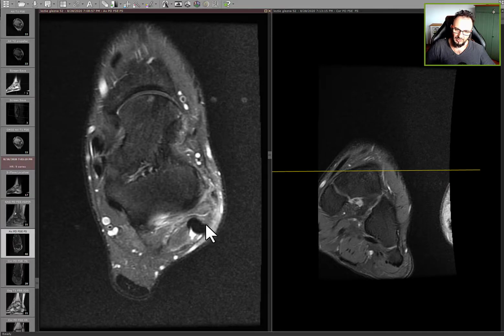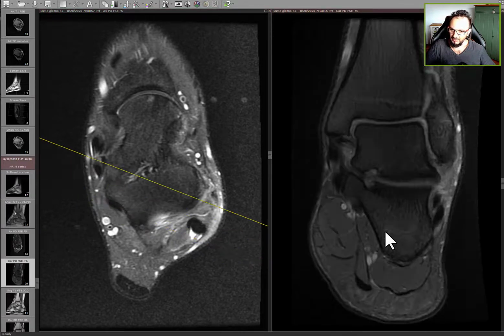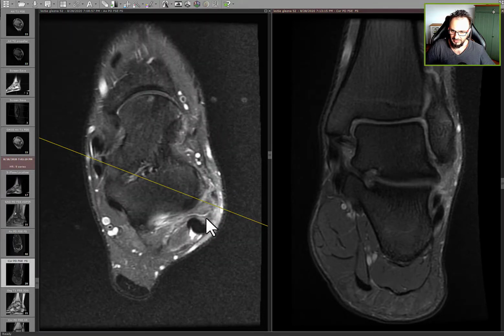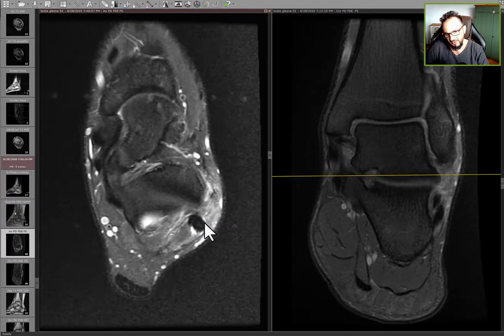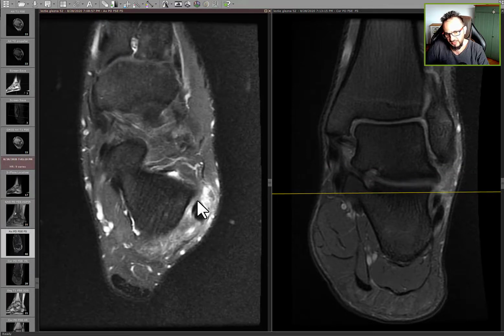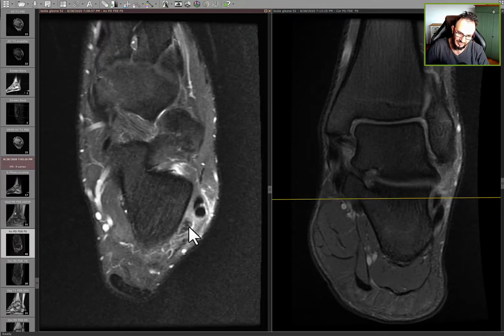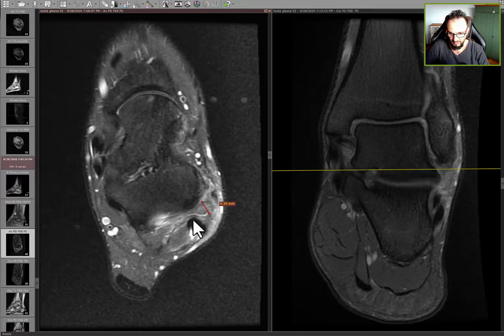But now, because the patient had another trauma, we see there is a very thickened fibulo-calcanean ligament. Is this ligament here, and we see the distal part, the calcaneal part, which is very thickened now, and it's not continuous with this part here.